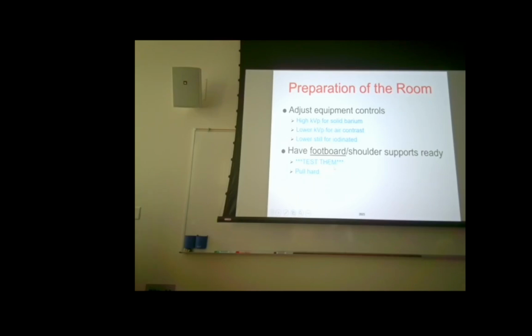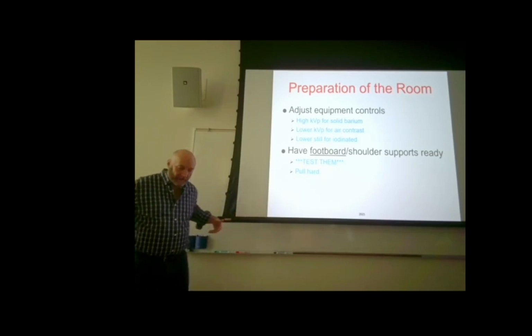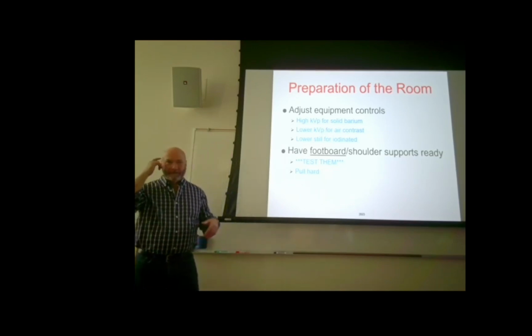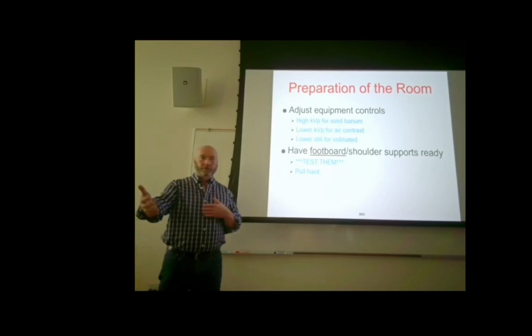All right. So the way the footboard loads onto the table are the little tabs. You have to slide it in from the bottom, and there are little tabs that have to fall into place. And sometimes they almost fall into place. It's kind of like, let's say you pull the door to your house almost shut, but it's not completely shut. It doesn't click into place, and then the air conditioner kicks on and it pushes your door open.